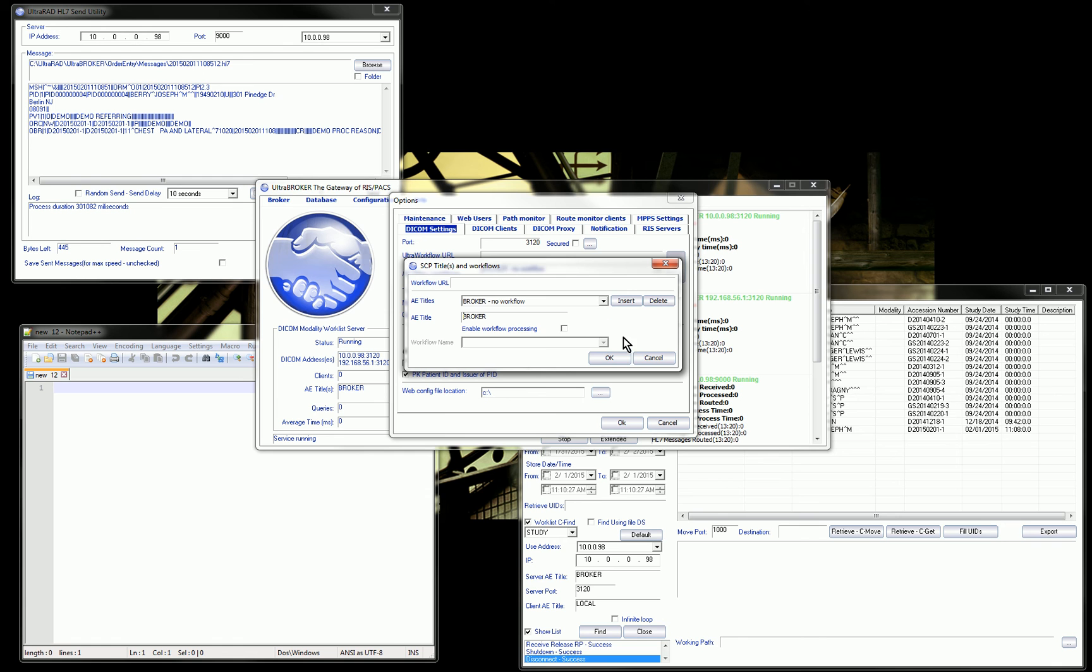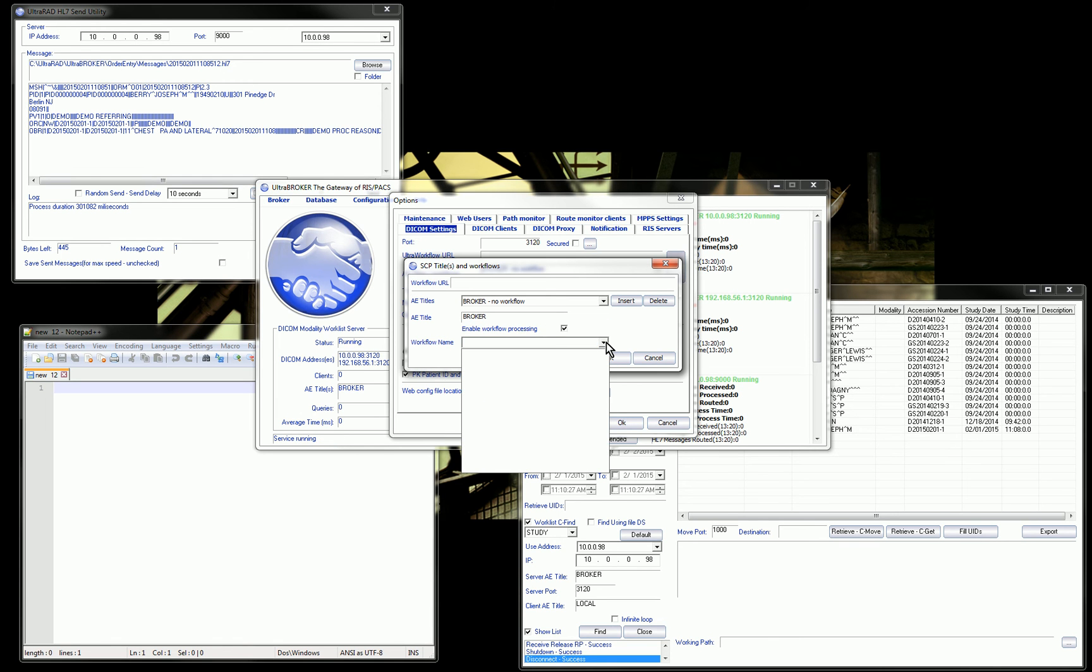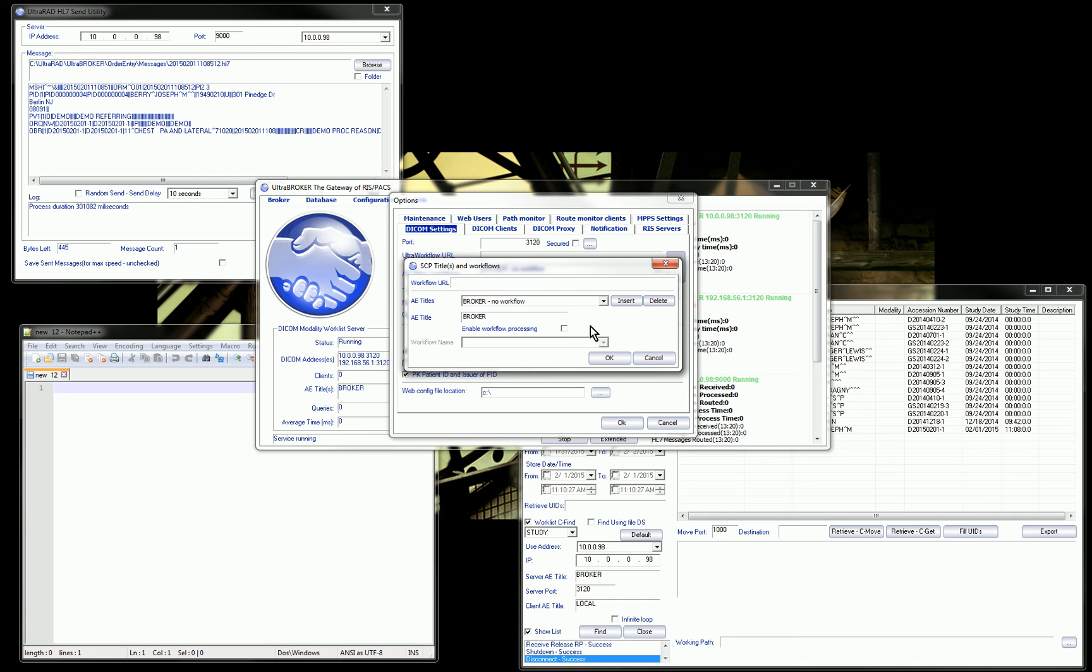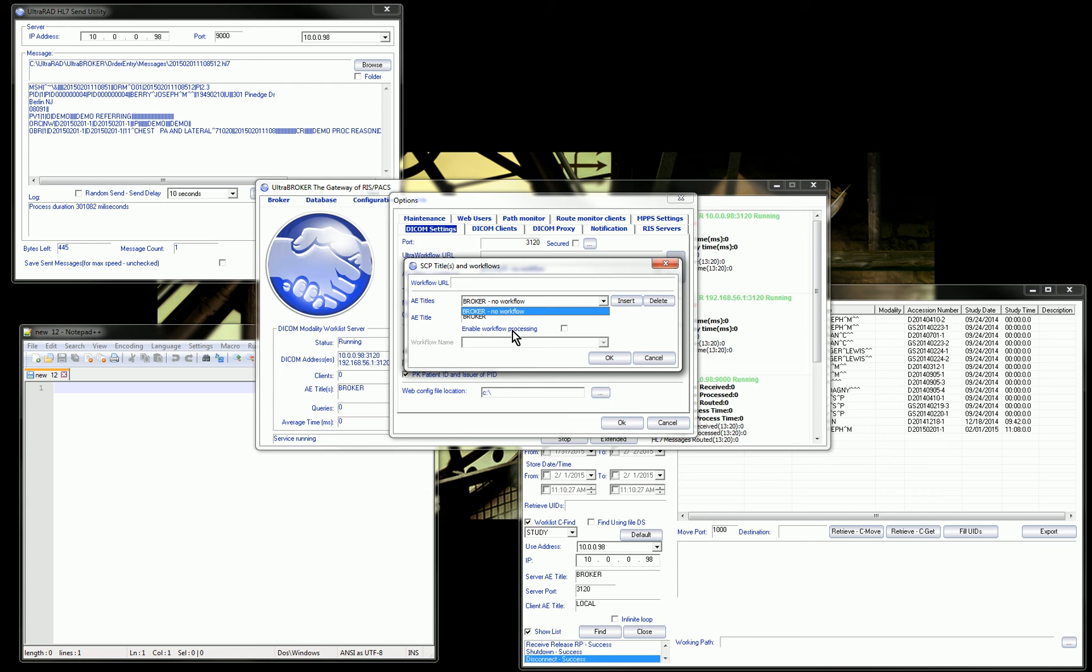If I go into my options in this section here where I configure my AE titles, when you configure an AE title for the broker, you can tell it to use other processes to get its information. That's where we would configure web services. I could have additional AE titles in this dropdown when a modality calls us with that particular AE title. We can trigger some kind of a workflow that maybe calls a web service on another system where it could generate other types of messages or use other standards like XDSI or CCR and CCD.